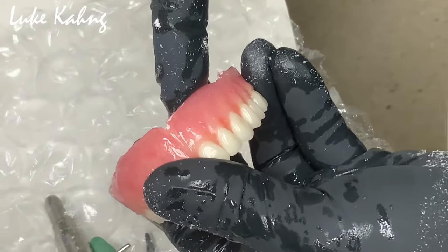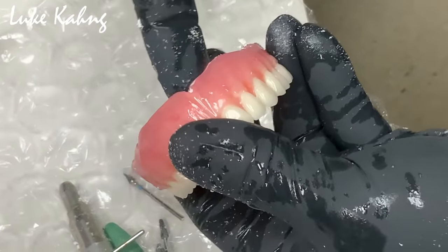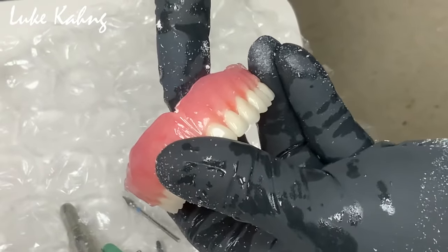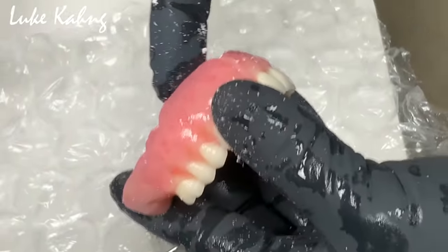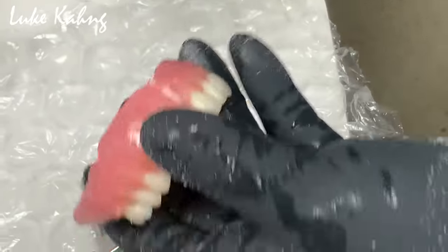Some labs I've gotten some dentures where they don't give me enough to the sulcus, to the border, and then you're in trouble, right? So right now what we're doing is simply adjusting because these are a little high, and that's perfectly fine. We take it down slowly until we get the perfect fit.